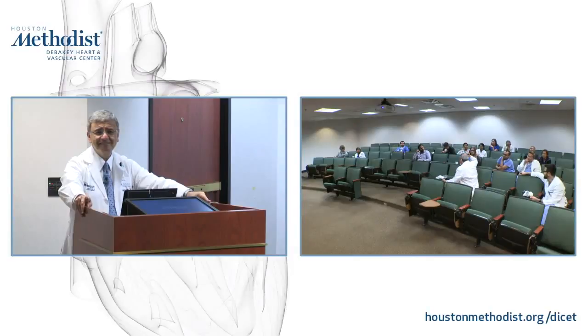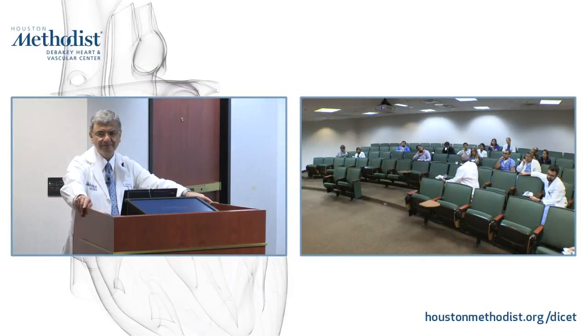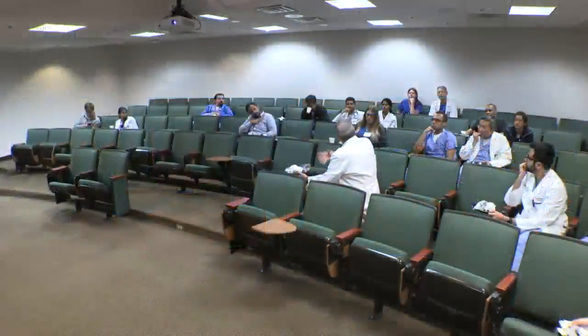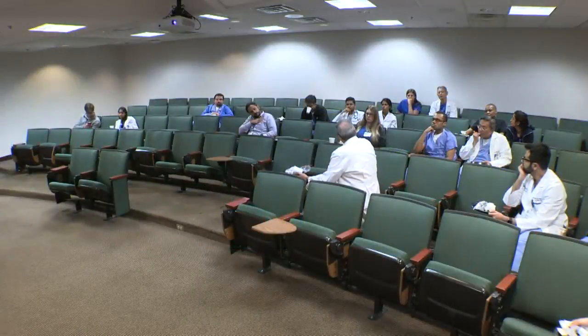One plea I do have is we're still not using enough, just even saving contrast for pulmonary pressures. And we're seeing a lot of hypertension patients. And we end up saying we cannot assess pressure. So please, keep that in your mind to use contrast when you cannot get a good TR. In those people, they're already coming to the lab because of pulmonary hypertension.